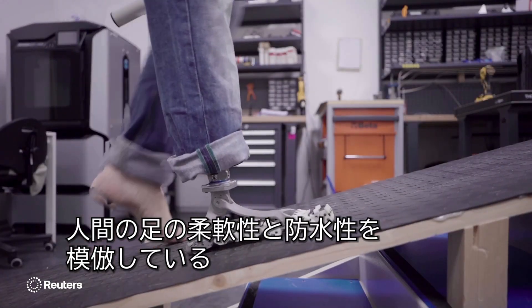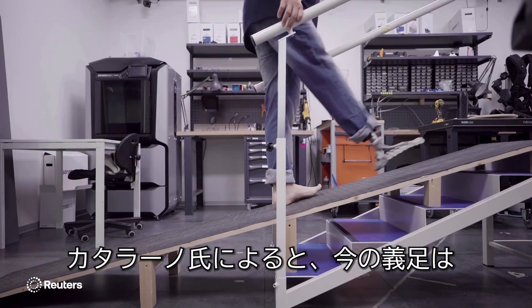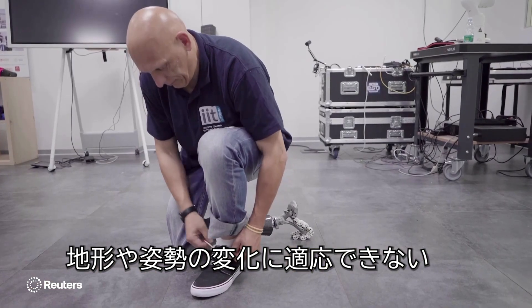The bionic foot mimics the flexibility and waterproof traits of a human foot. Catalano says that current prosthetics have flat or low compliant feet, meaning they aren't able to adapt to changes in terrain or posture.